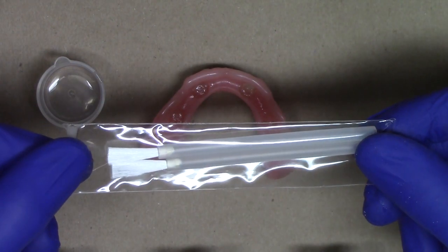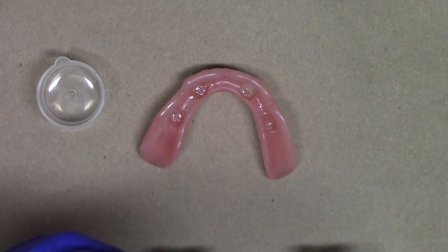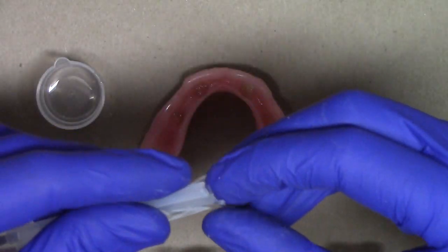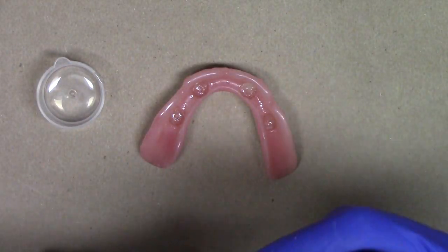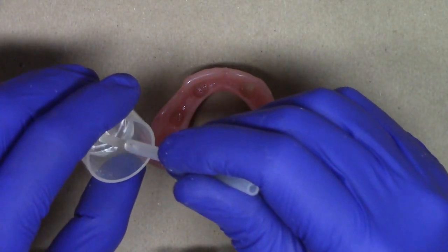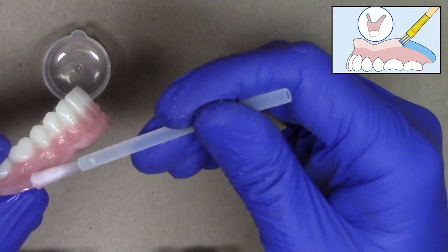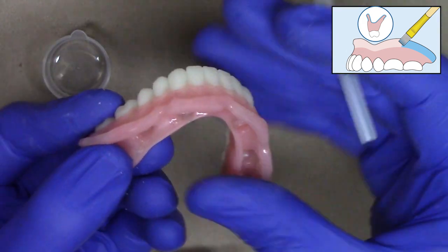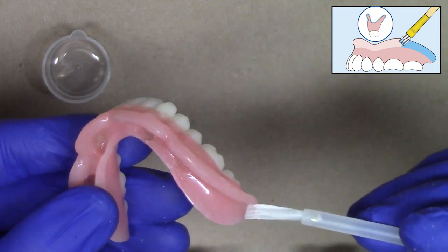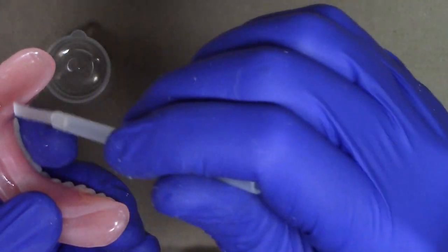Additionally included in our soft reline box are these convenient little brushes, which I'm going to open with a pair of scissors so that I don't bend them. And removing our little brush, it's just the right size to dip into our primer. And now, very carefully, in a gentle motion all the way around our denture, starting at the borders, ensuring that the primer is evenly coating the entire surface of the denture.